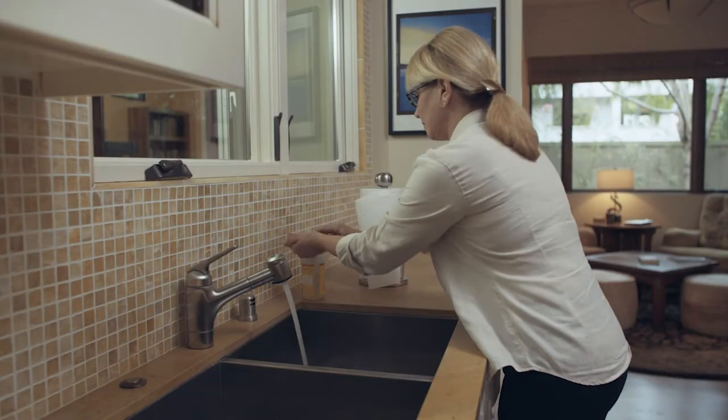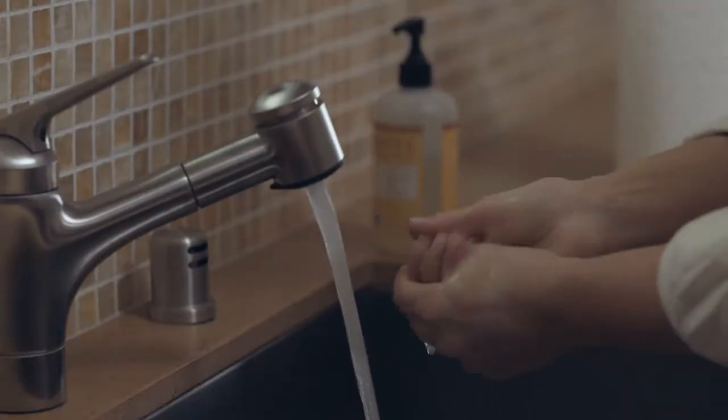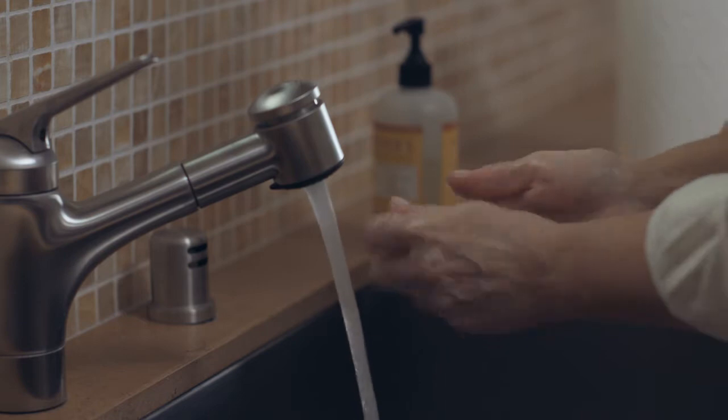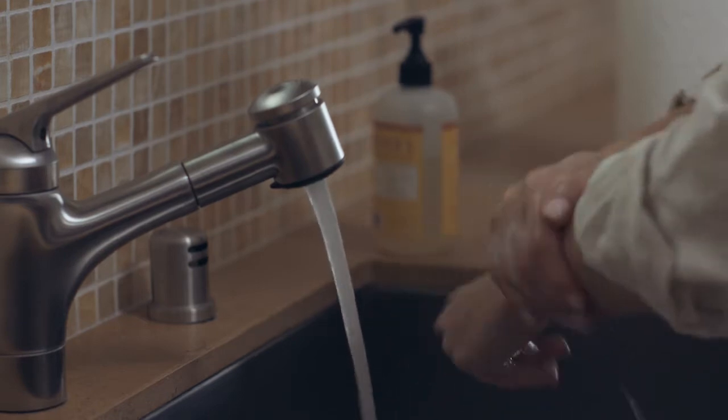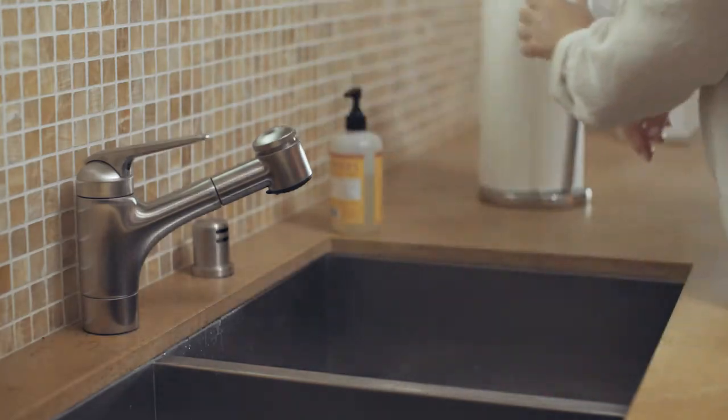Before beginning each drainage procedure, remove any rings and wash your hands thoroughly with soap and water for a full minute, even though you'll wear gloves during the drainage procedure. Dry your hands using clean paper towels.